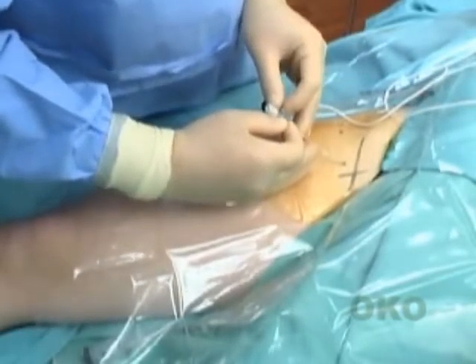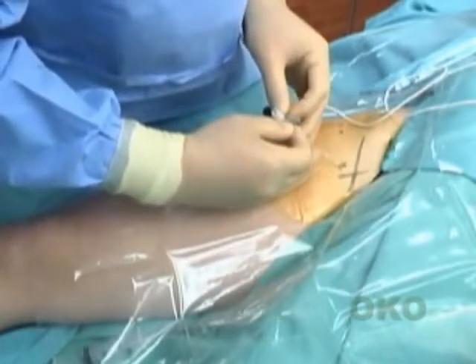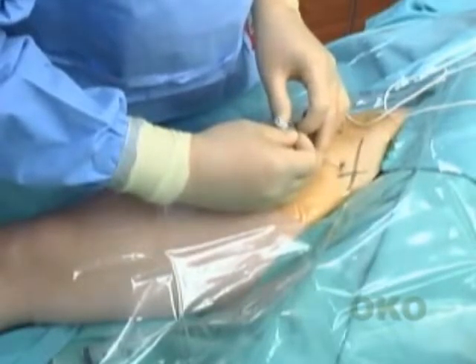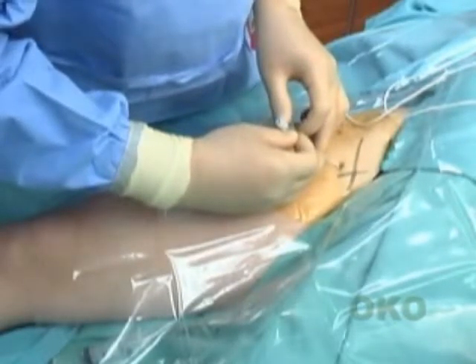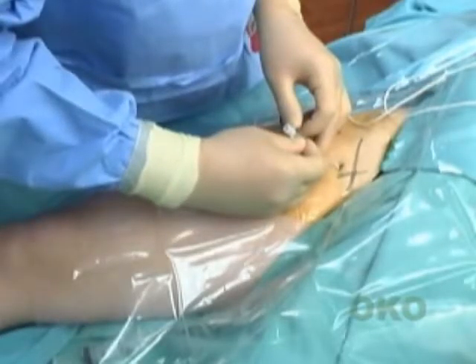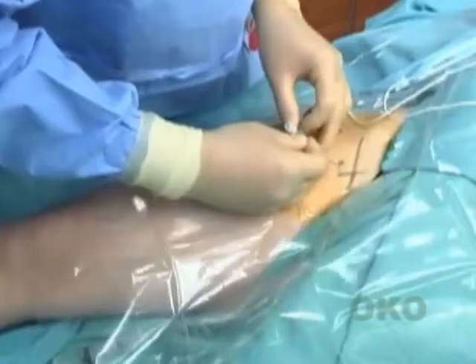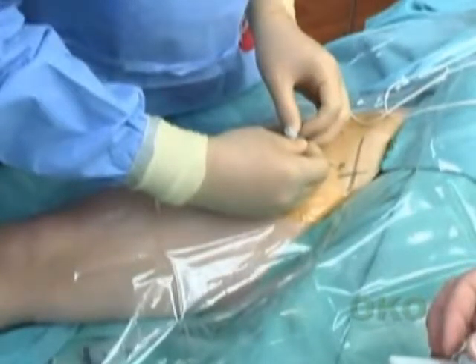The patient is positioned supine with the foot neutral, neither externally nor internally rotated. After palpation and marking of the femoral artery and the inguinal crease and disinfection of the skin, the area is covered with a sterile fenestrated transparent plastic drape.